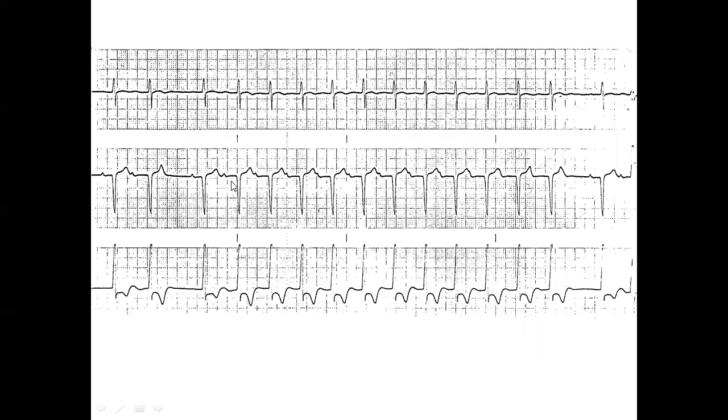And PR short, long, longer, typical Wenckebach phenomenon. What is the P? Well, you have to take out your caliper and march it out. It's there. What is the next one? It will time on top of the T, and it will time on top of the T. And it's the P here that's blocked, and next cycle begins.